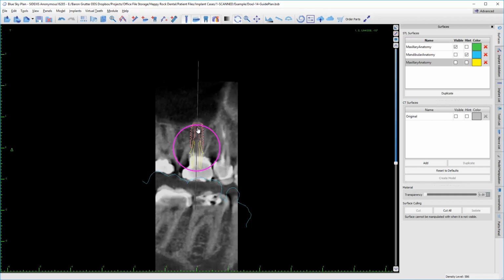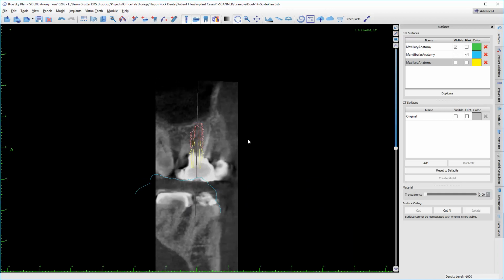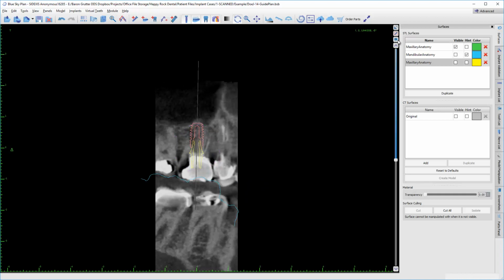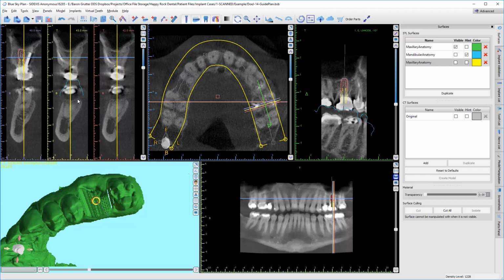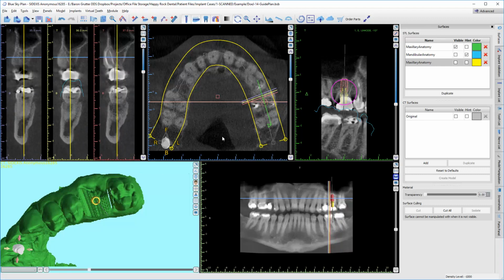Now, because I'm right at the floor of the sinus, I'm going to drill this full, place the implant, and probably just continue to keep threading it in until I feel like it's at the depth I want. I don't think I need to do an actual sinus lift in this one, but kind of a sinus bump by just pressing upward. But let me evaluate. Is that a true septum? Yeah, it's not an actual septum. Okay, good deal. So there we go.